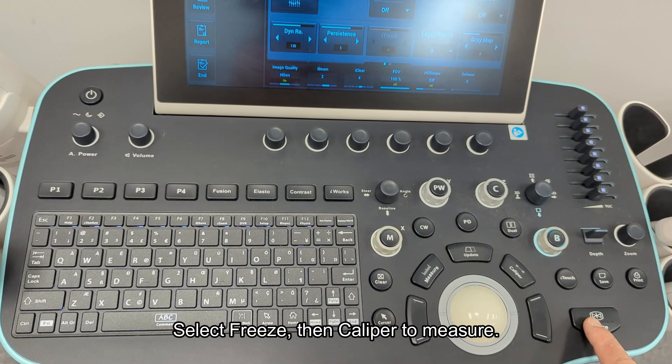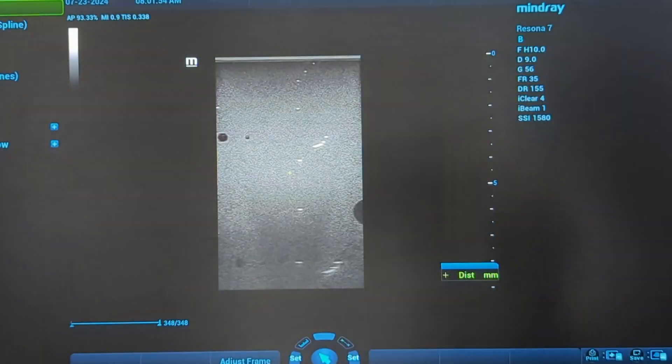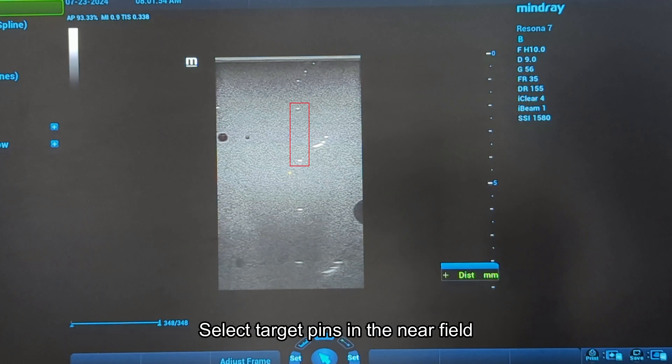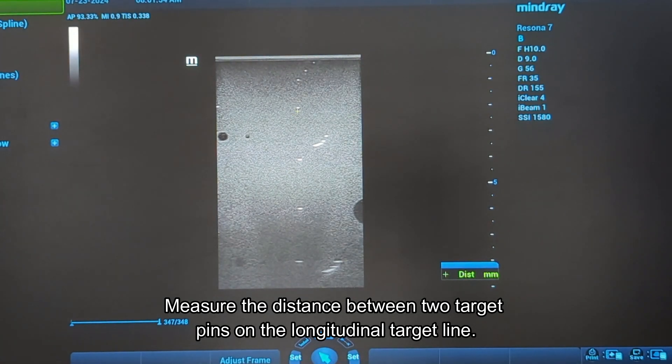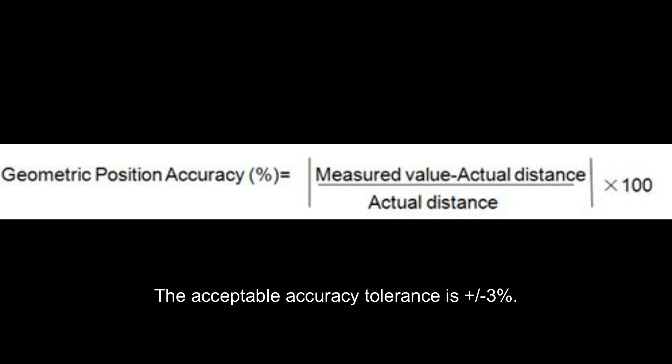Select freeze, then caliper to measure. Ensure target pins are in the center of the scan image. Select target pins in the near field and measure the distance between two target pins on the longitudinal target line. Use this formula to calculate the axial accuracy. The acceptable accuracy tolerance is between plus three to minus three percent.